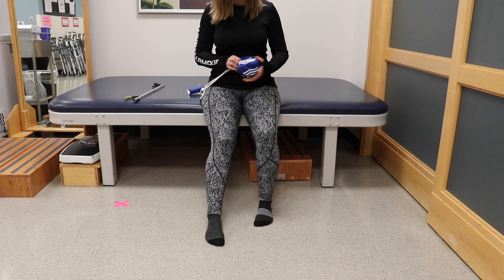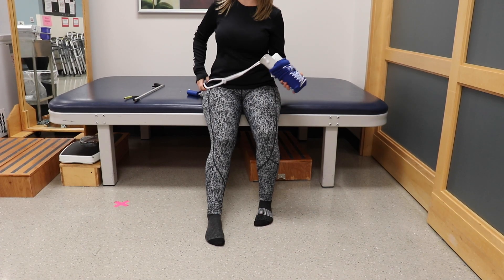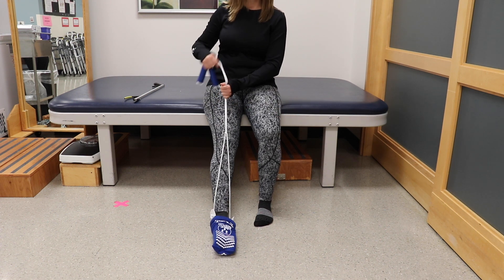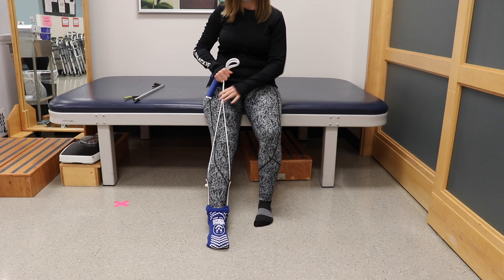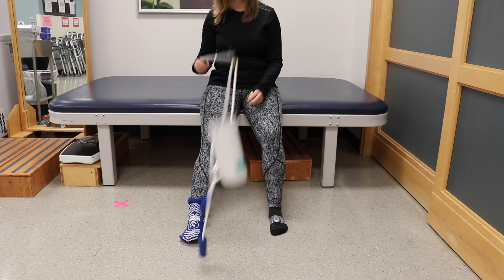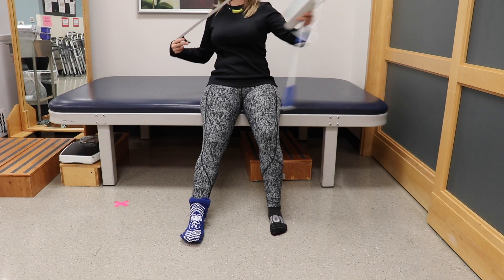Place your sock on the aid. Hold on to the end of the string to drop the end of the sock aid to the floor. Slide your foot into the sock. Use the reacher to straighten up your sock and pick up the sock aid off the floor.